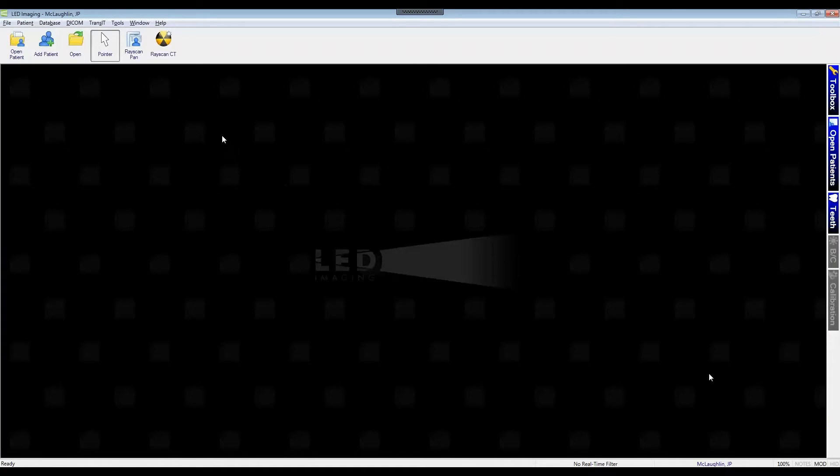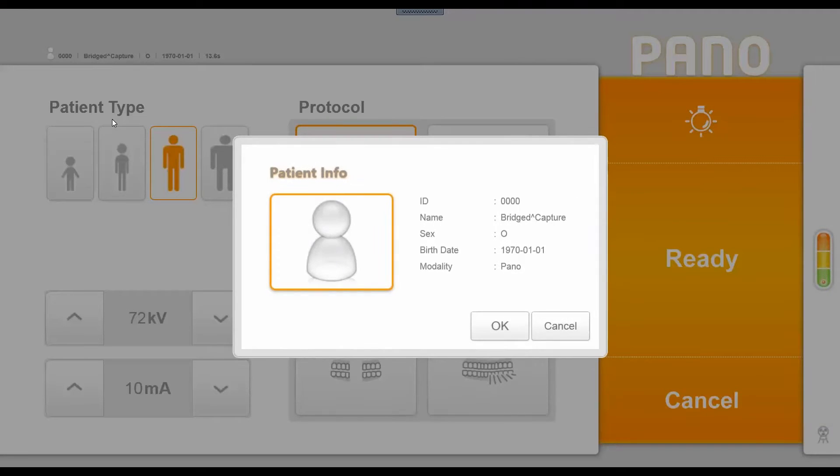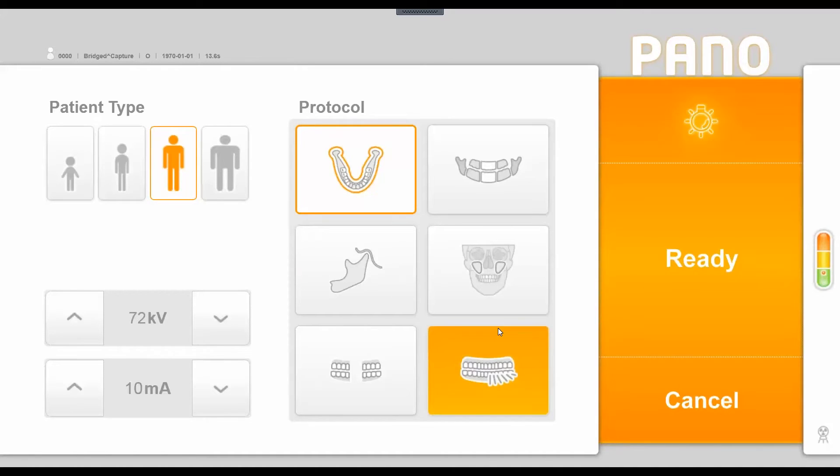From LED Imaging, I'm going to click on the RayScan panoramic icon, which gives us a window to choose between panoramic and cephalometric imaging. I'll choose panoramic, which launches the RayScan acquisition interface. The first window shows patient information — for panoramic and cephalometric imaging it lists the patient's name as bridged capture while keeping the image in their account. We click OK and the machine initializes, resetting itself to a home position automatically.